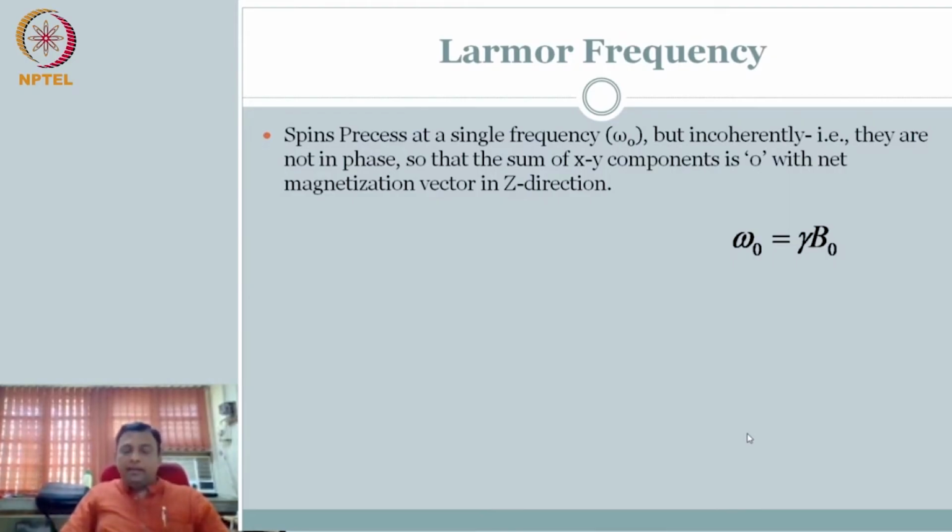But pretend now I am subjecting this to an external magnetic field, right? And let's say that is my voice command saying, everybody align the spin in the direction going from floor to roof. So the moment I say that, each of you is initially at a different direction, so the net vector is 0. But now I have instructed you to all align along the direction going from floor to roof. This is akin to applying an external magnetic field in the plus z direction.